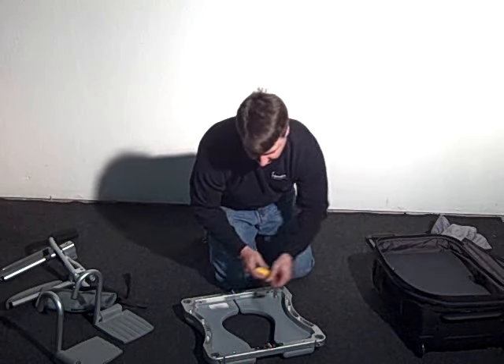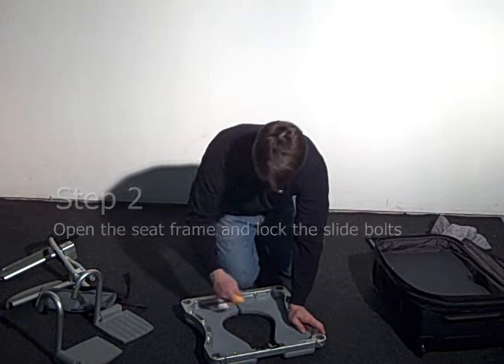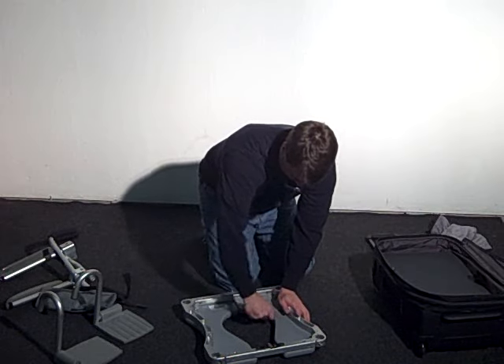Then unfold the seat frame and slide and tighten the slide bolts using the included T-handle Allen wrench.